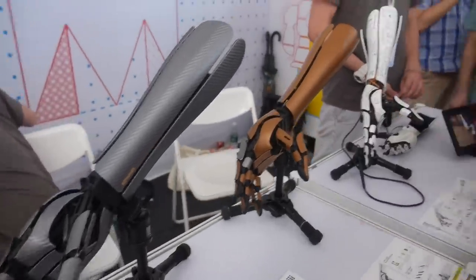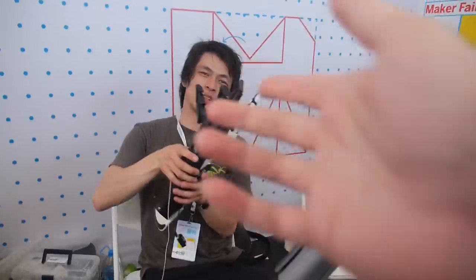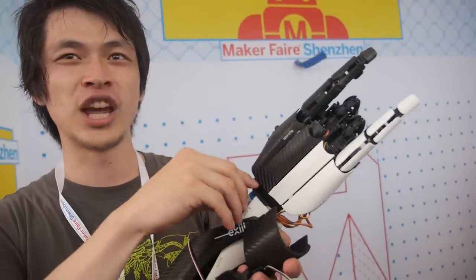And here we have a crazy arm. What is this? This is Project Cap. Project what? Project Cap. Bionic arm. Where are you from? We come from Japan.